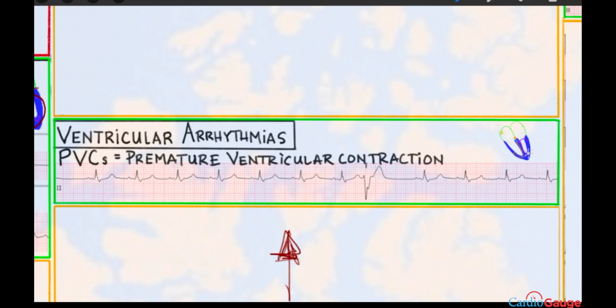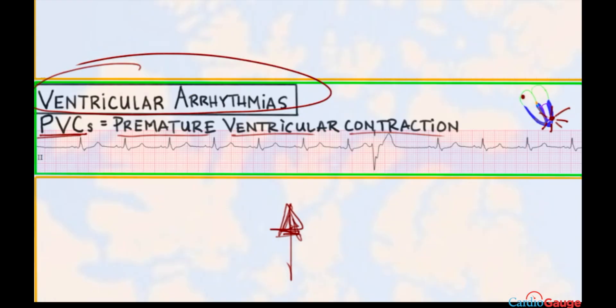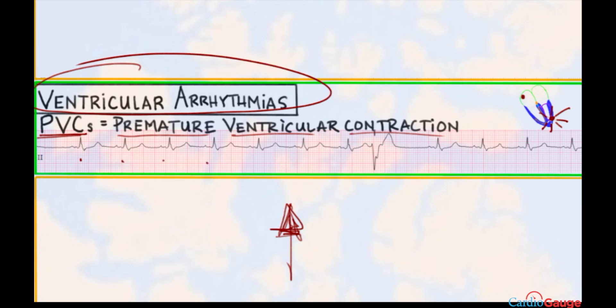Let's talk about ventricular arrhythmias — specifically PVCs, premature ventricular contractions, which come from the ventricle. A spot in the ventricle fires and creates the beat instead of the sinus node. You can see beats with a P wave before each QRS, and then suddenly there's no P wave — just a QRS that comes early. The QRS has a very different morphology than a sinus beat: it tends to be wider, and the T wave tends to be large and in the opposite direction. When the morphology of a beat is very different from the sinus beat, there's a good chance it's a PVC.